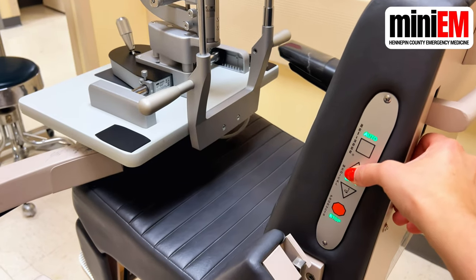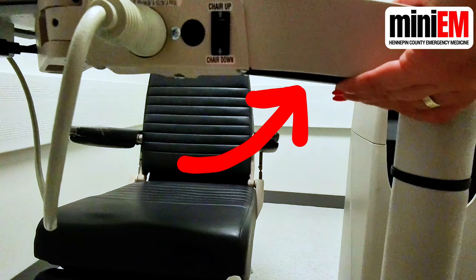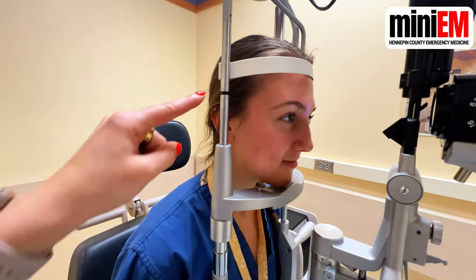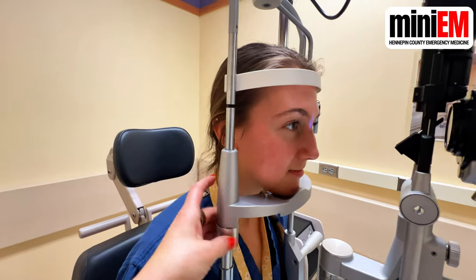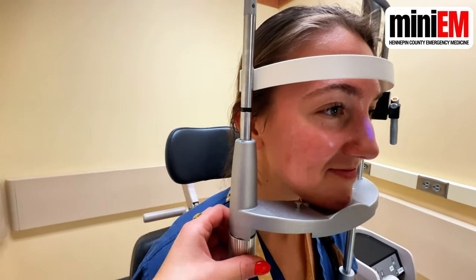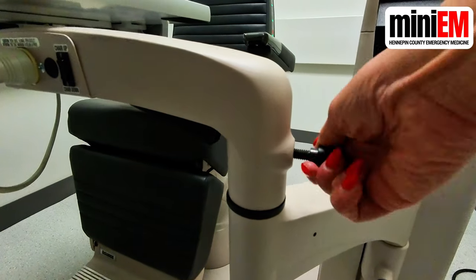Now get your patient into the chair. Raise the chair up and down for their comfort. Raise the table up to meet your patient by pulling this lever. Have them rest their chin here and place their forehead flush against this bar. Find the black mark on the frame — you want this to line up with your patient's lateral canthus. Rotate the knob right below the black mark until it's lined up, then turn this knob to lock the table into place.